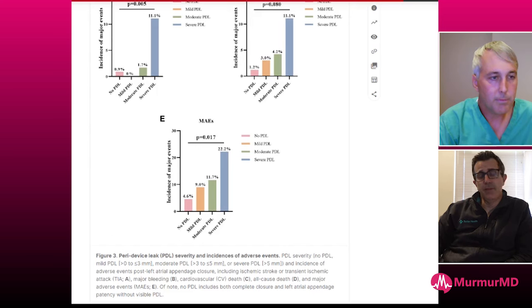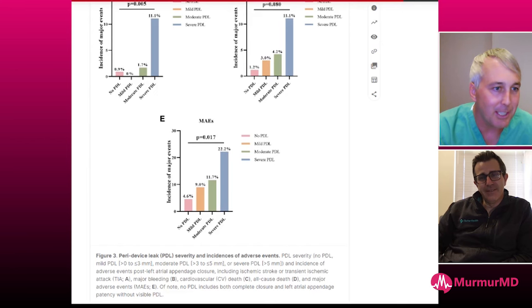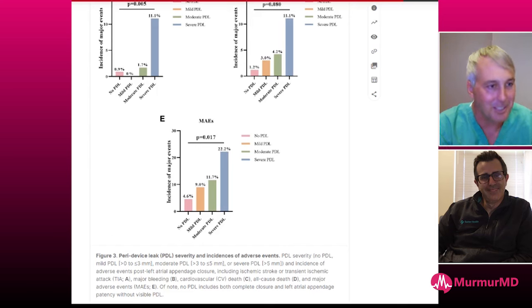Right. Well, thank you very much. You hit some of the things that I have questions about, and I'm sure many other people have questions about what you commonly see on CT. And it's nice for you to illustrate from a cardiologist and implanter's perspective how to analyze these things without the radiologist alarmist approach of thrombus. Yeah. I joke that as cardiologists, we're the only specialty in medicine not looking for cancer all the time. When you're a radiologist, you're trained just to find things and report them, but a lot of times there's some nuance.